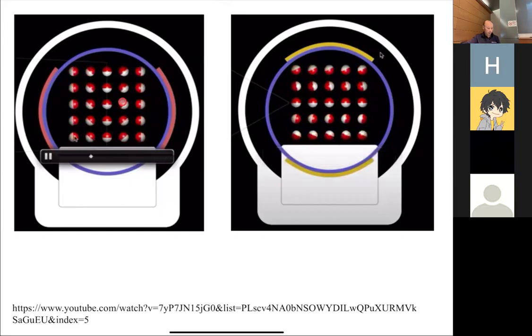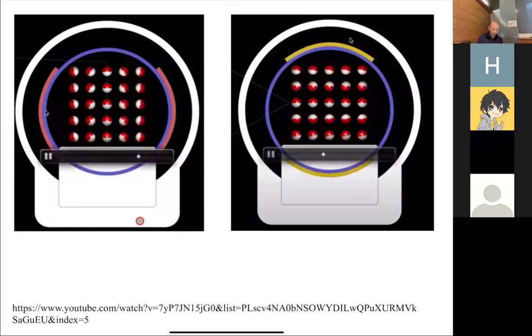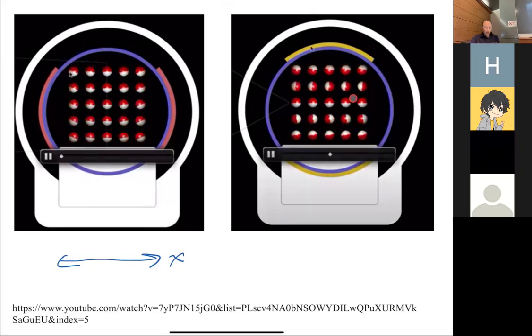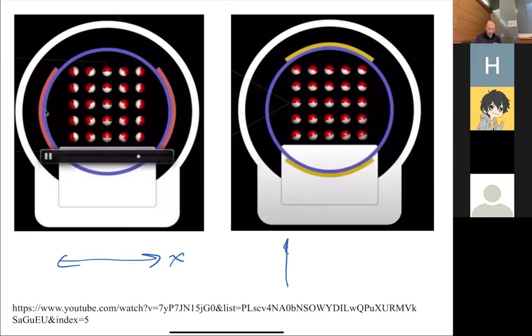And so you can look at that, the orientation of the rotation is different here. So in this case, there's a gradient going this way, right? That's the orientation of the gradient, because I'm causing variations in that direction in the rotation. If I look at this one here, everything is okay this way. So all the differences are happening in this axis. So here I would have applied a gradient in the y direction.